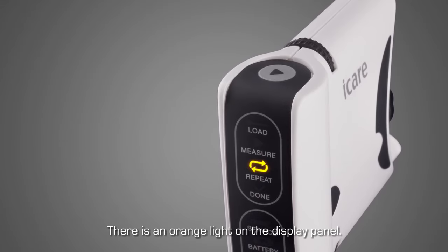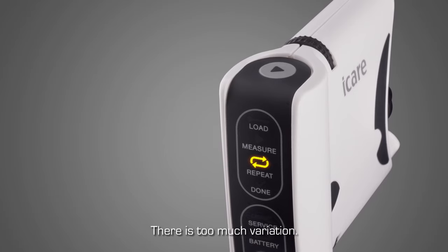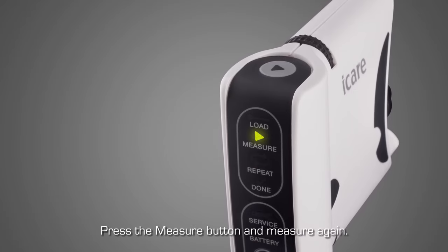If there is an orange light in the display panel after the measurement, there is too much variation in the measurements. Press the measure button and measure again.